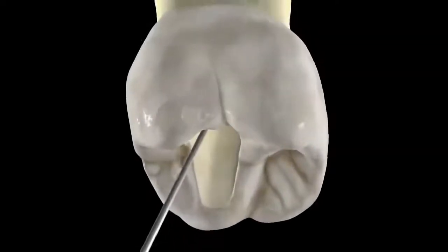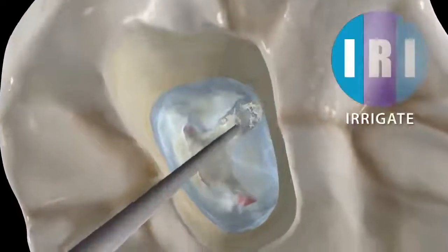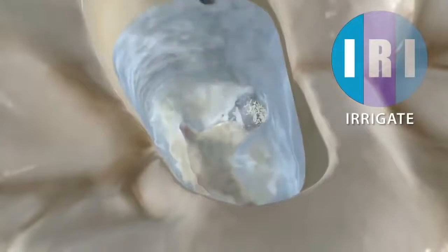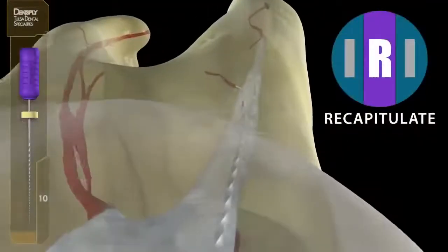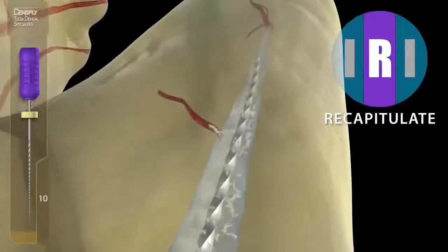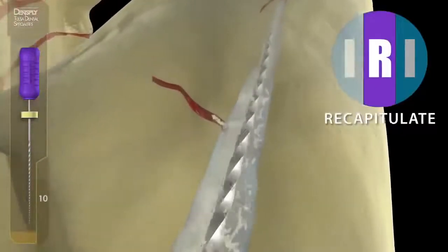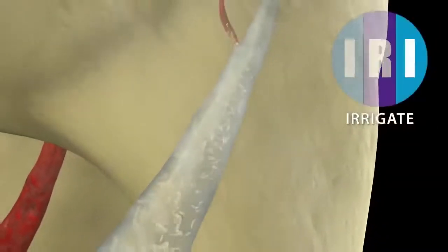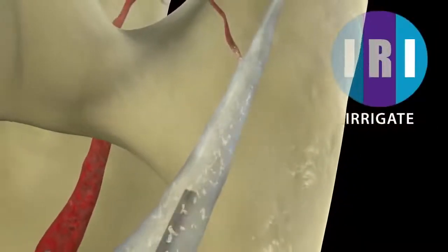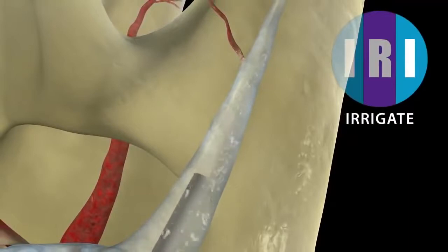We irrigate with full-strength sodium hypochlorite, which puts any dentin mud into suspension so we can easily recapitulate and remove it. Remember, dentin mud and collagen are the fatal flaws of endodontics. Sodium hypochlorite will digest detached collagen, so irrigation is an absolute must and you can't do enough of it.